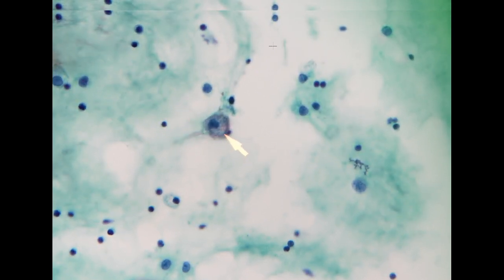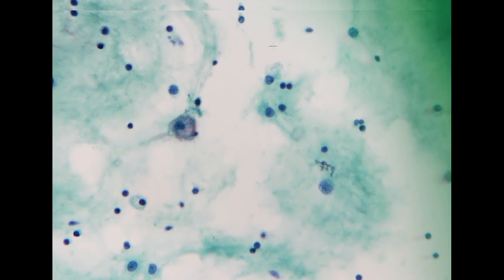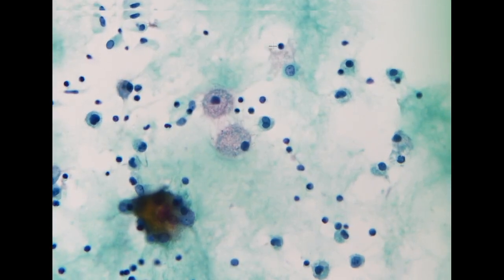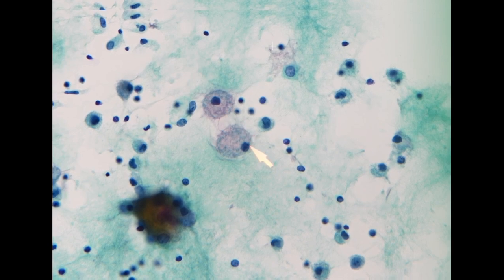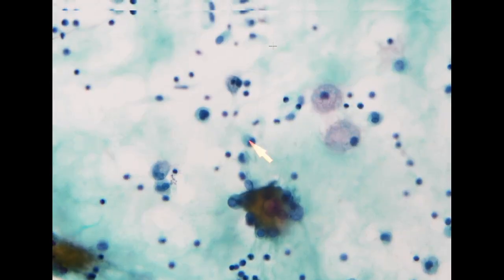So here again, you can appreciate that some of the cells have more eosinophilic material in the cytoplasm. I have to say some of these cells actually look very, very similar to a histiocyte. So these actually look more like a so-called mucophage, a histiocyte engulfing some mucous material, than a true signet ring cell carcinoma.